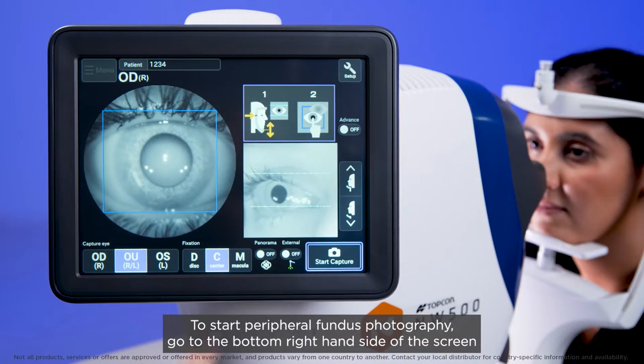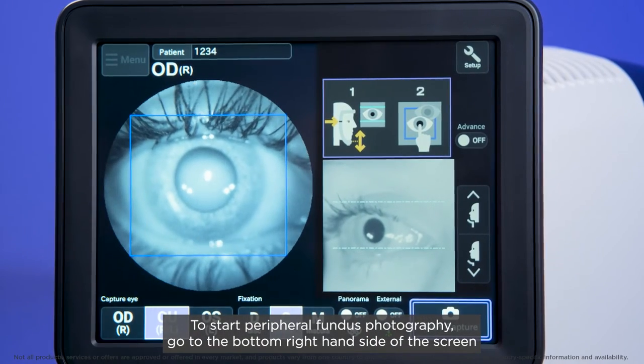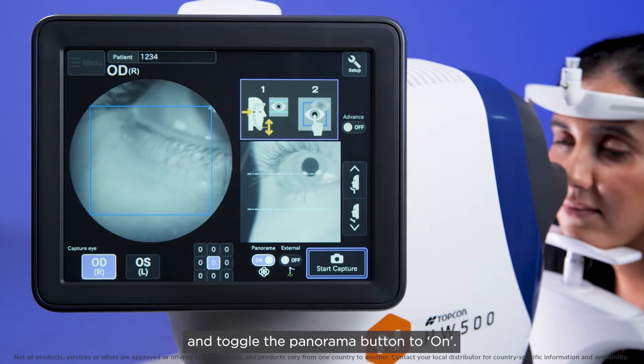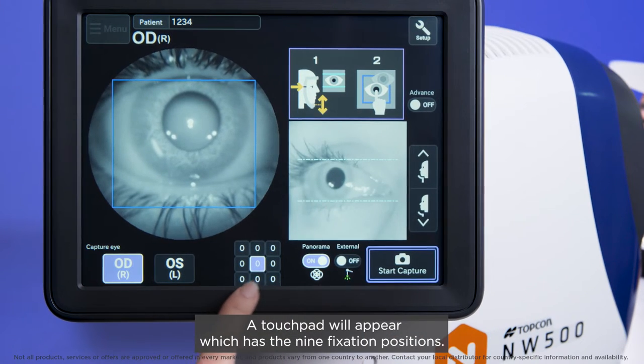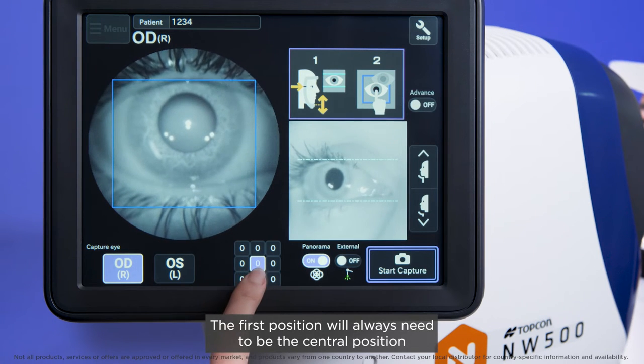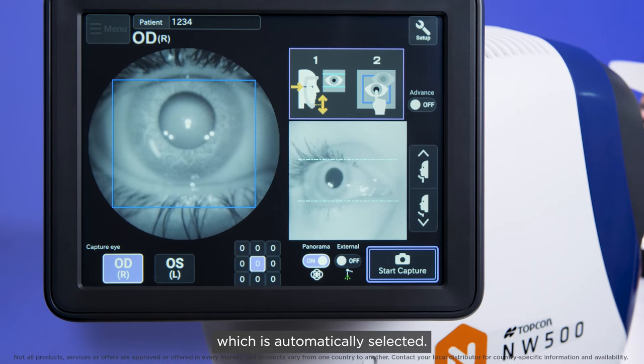To start peripheral fundus photography, go to the bottom right hand side of the screen and toggle the panorama button to on. A touchpad will appear which has the nine fixation positions. The first position will always need to be the central position, which is automatically selected.